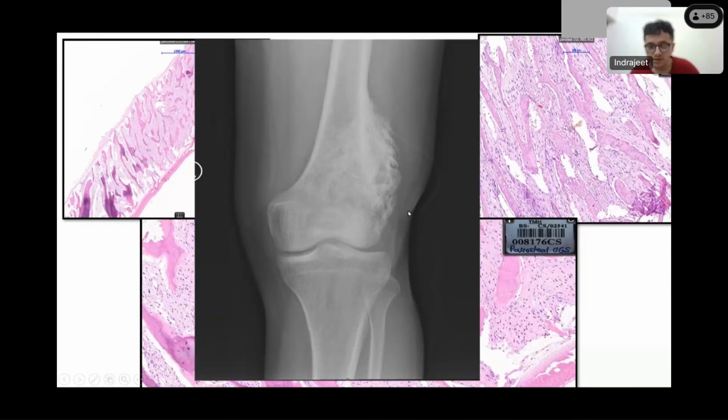So yeah, I wouldn't call this classic sunburst. What I can say on this X-ray is that I see a big tumor, which is around the metaphysis. Probably I'm seeing it on the surface of the distal metaphysis, right? Now remember, this is a 2D image. Your surface tumor may seem like it's coming from the medulla, right? But you see this long frond lacy-like osteoid that you see on the periphery, which seems like it's arising all from the periosteum, right?